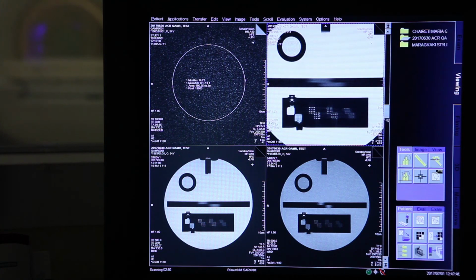Okay, I think this is the last check we have to do. There's a lot of work to be done in post-processing. Of course, the post-processing with these machines, and generally the machines that we sell, you don't have that in many facilities. So you have to move the data to other workstations. A lot of software works in these areas, but you can find free software to continue with the post-processing.